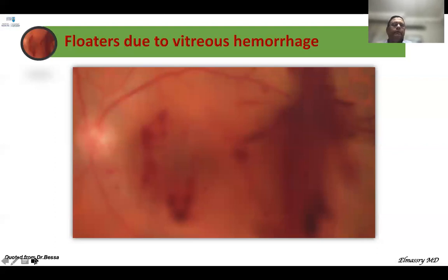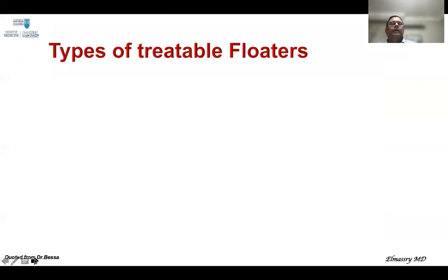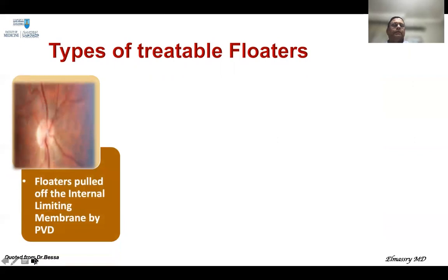So these are the non-lasered floaters. The floaters that we can treat with YAG laser vitreolysis are those pulled off the internal limiting membrane by posterior vitreous detachment. And again, I'm stressing: for any patient who needs YAG laser vitreolysis, you should have total posterior vitreous detachment.